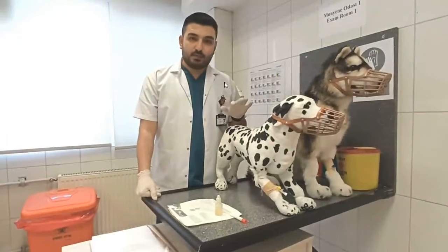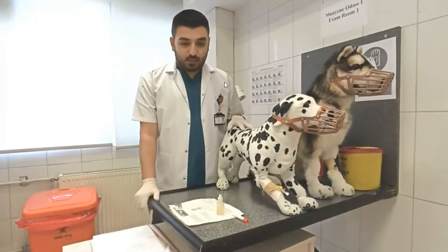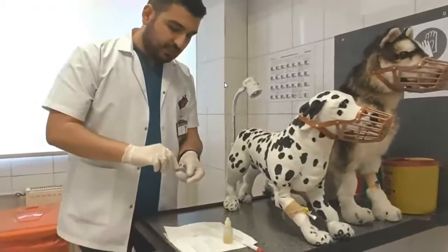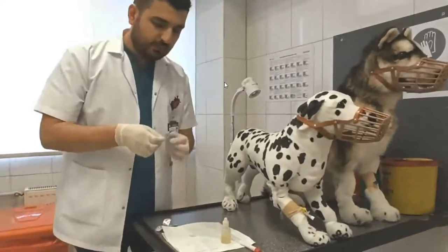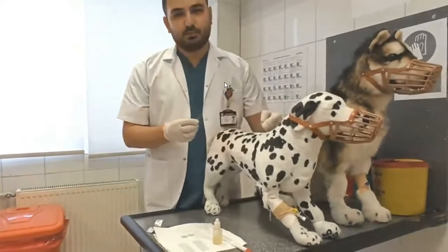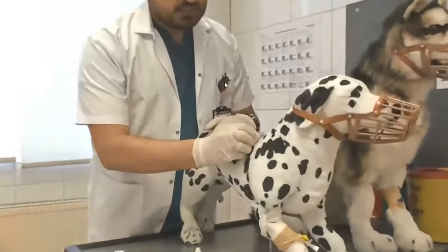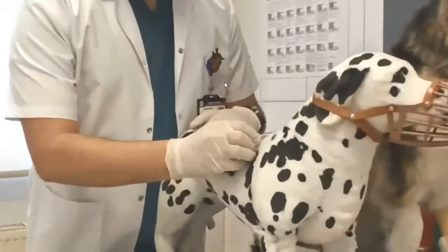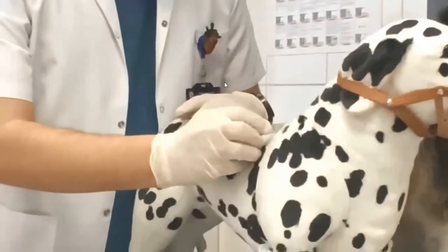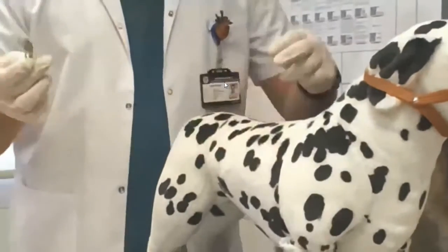I want to talk about how to prepare the samples for the dermatological exam. First, let's prepare a skin scraping. Here we have a blade, and here we have a lesion. Slowly causing some redness on the skin — you can see a small volume of bleeding on the skin. It's enough for examination.